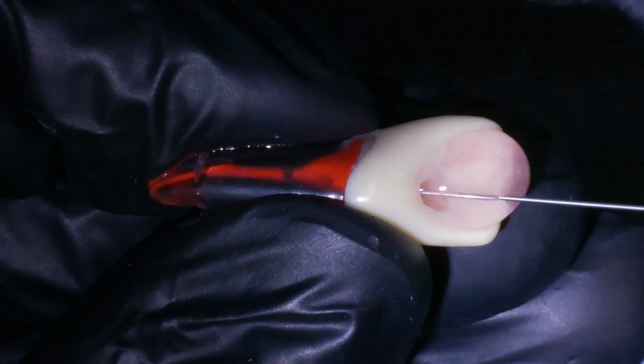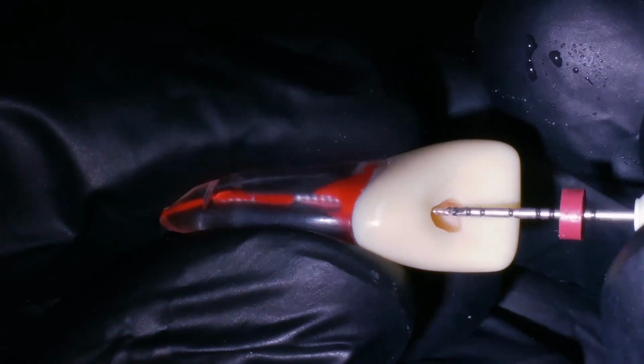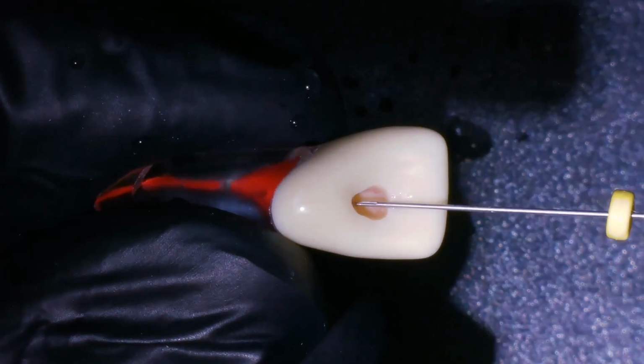Reach the working length with 3 strokes or 3 seconds, then retrieve the file. Don't leave it spinning unnecessarily at the apex. Always keep the canal filled with irrigant during cleaning and shaping.